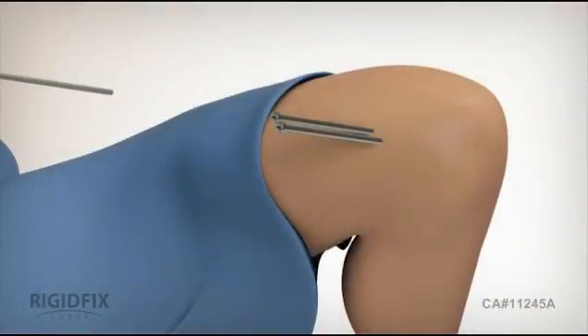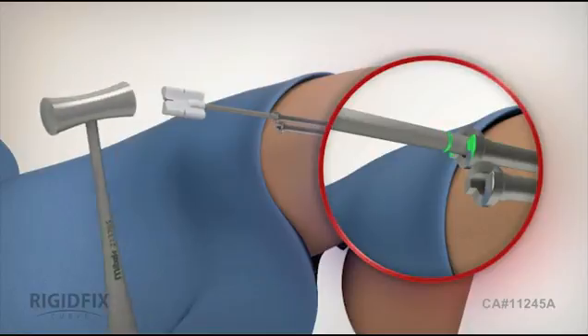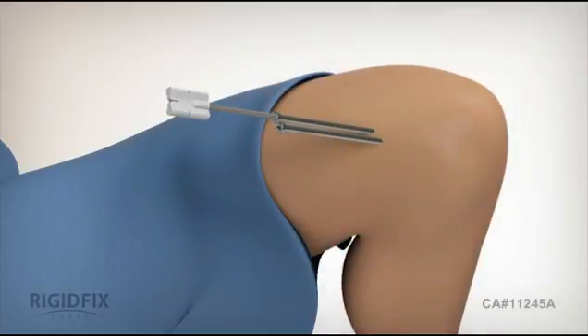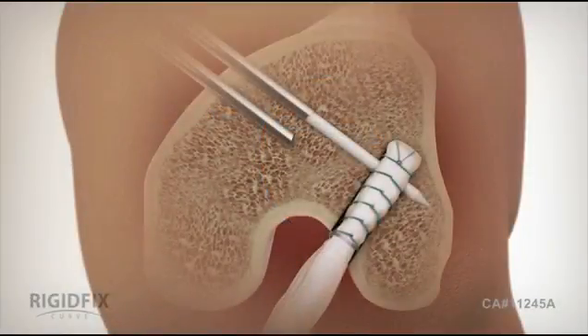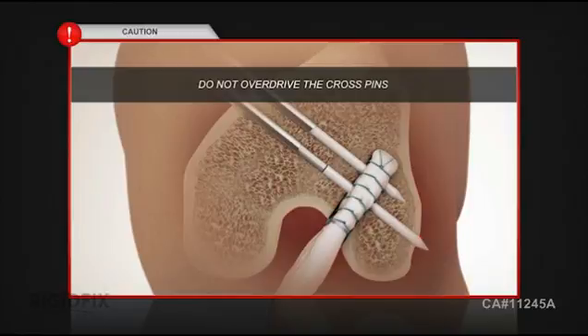Insert a cross pin into the top sleeve using the pusher rod and small rigid fix mallet. Gently advance the cross pin until the laser line on the pusher rod is aligned with the top surface of the sleeve. This ensures that the cross pins are placed in the correct location with respect to the femoral tunnel. Then repeat these steps to insert the second cross pin through the bottom sleeve. Do not overdrive the pins. Make sure that the laser line on the pusher rod is aligned with the top surface of the sleeve and not beyond it. If the laser line is advanced beyond this position, then lateral bone stock is reduced, which increases the risk of cross pin protrusion through the lateral cortex.